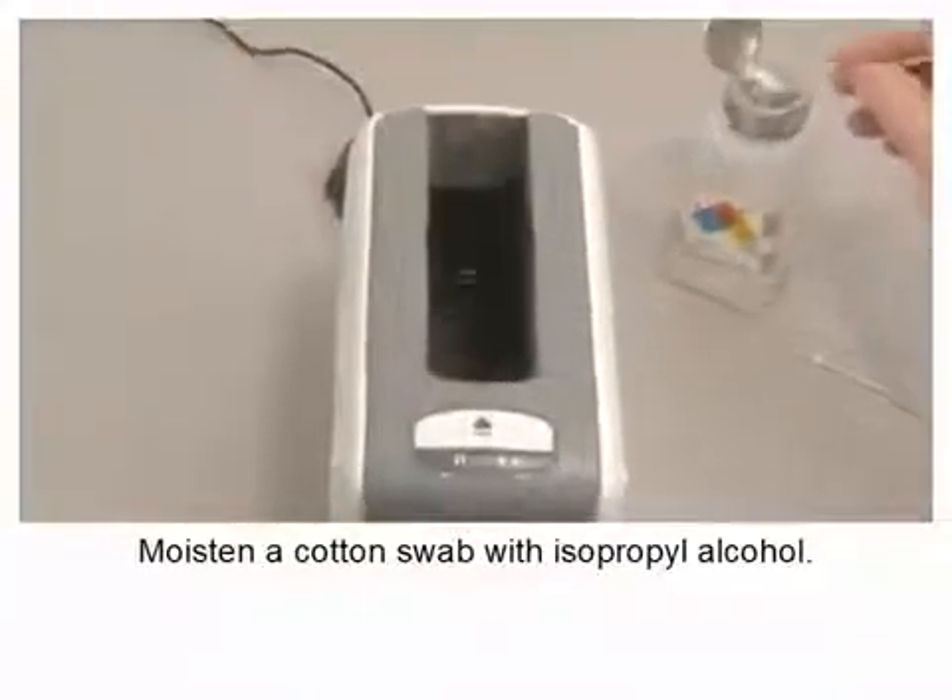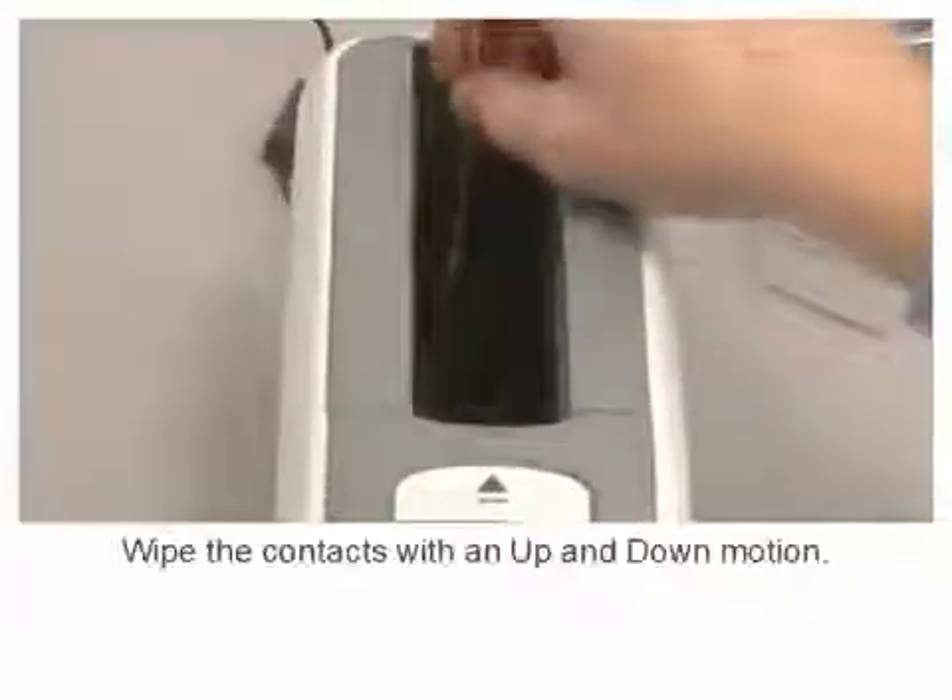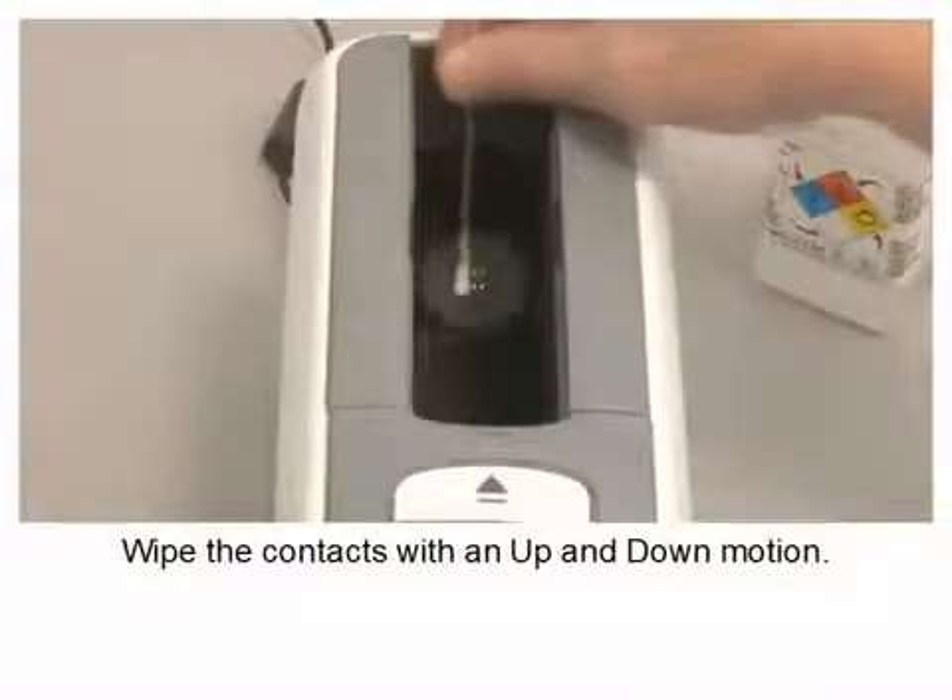Moisten a cotton swab with isopropyl alcohol. Wipe the contacts with an up and down motion.